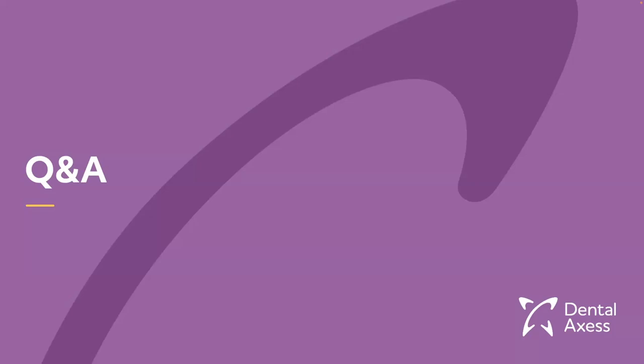The pictures, on the other hand, are very important, because sometimes one of the requests of the doctors sending cases is to improve midlines. But if I don't have the picture of the midlines, the smile picture, I don't know which one is correct and which one is not. I always base it on the upper being the correct one.